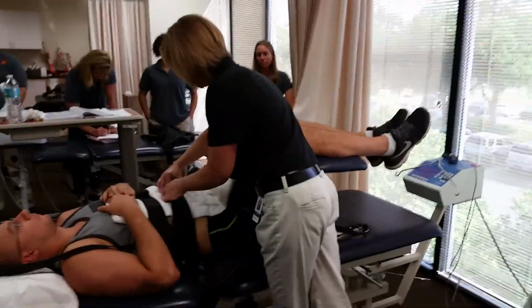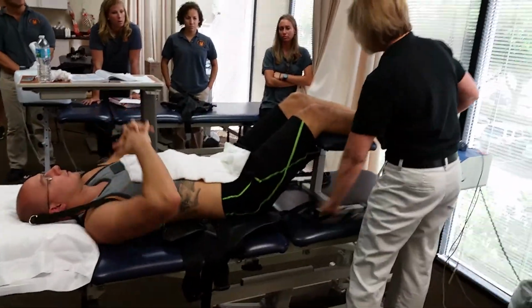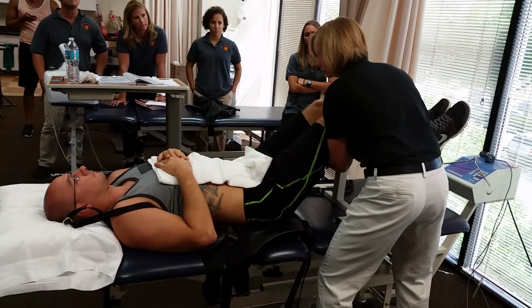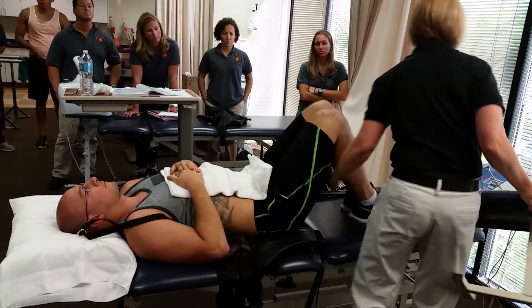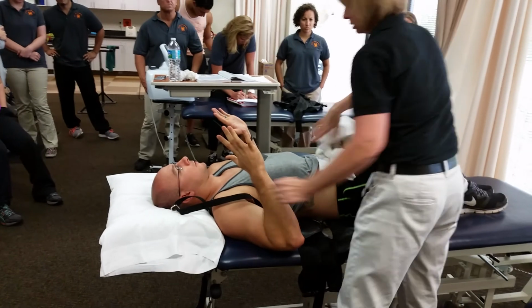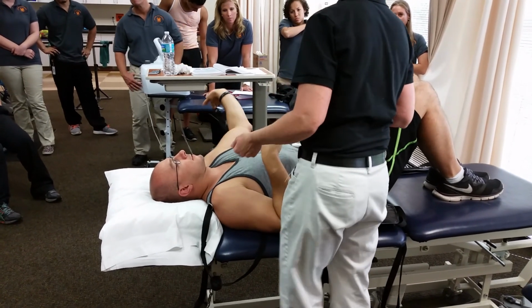And after I know that he's adjusted, I take this off. Now I'm going to remove the legs from here. So what I'm going to do is I'm going to lift this out. When I do, just bend your knees and put your feet flat on the table. Okay. Bend your knees, flat on the table. This out of the way. You can pull your shirt down. You can take your arms out of this. That's a stinky. Yeah, it is.